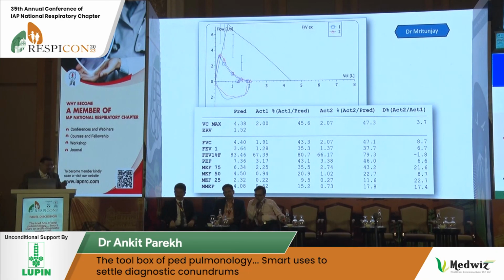So just one comment on the lung function, Dr. Mrityunjay. This patient simply does not show any pre and post bronchodilator change or improvement. So this is a patient who has obstructive disease, who is not improving. Yes. So there is a definite obstruction which you can appreciate in the graphs. You can also see that there is no significant change after giving a bronchodilator. It's a mixed pattern basically. Yeah, it is a mixed pattern also. The FVC is very poor, 43%.